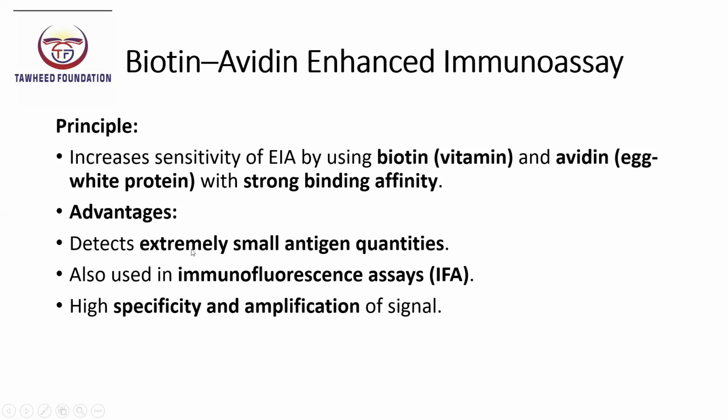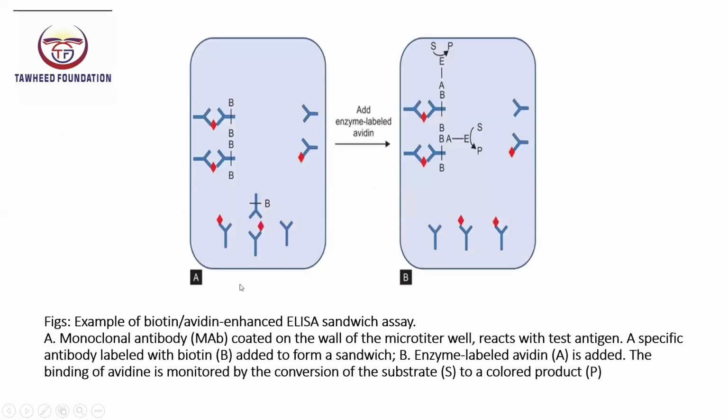Advantages: it detects extremely small antigen quantities. It is used in immunofluorescence assays, that is IFA, as well. It provides signal amplification and high specificity.